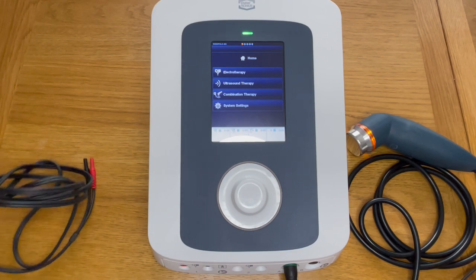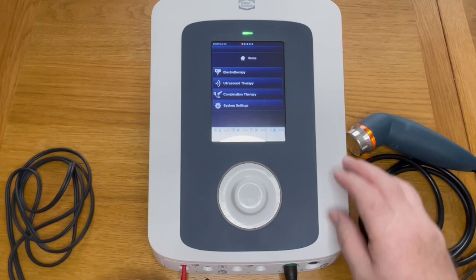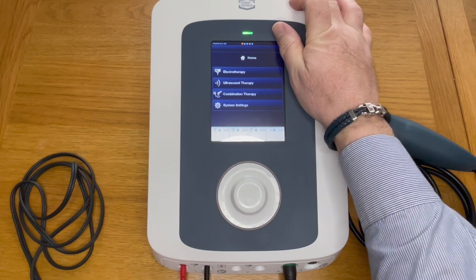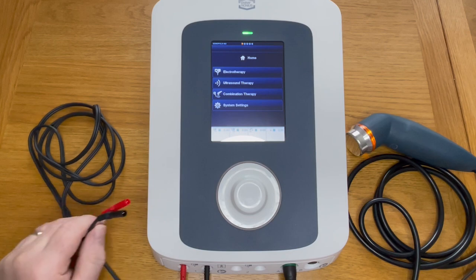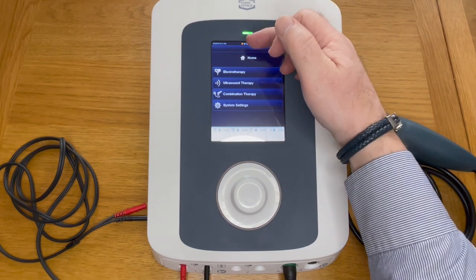On the left hand side we have two cables for electrotherapy. We plug the red into the red port and the black into the black port on channel one, and that allows us to have this cable for plugging into our electrodes.